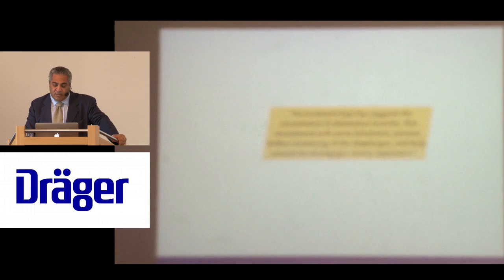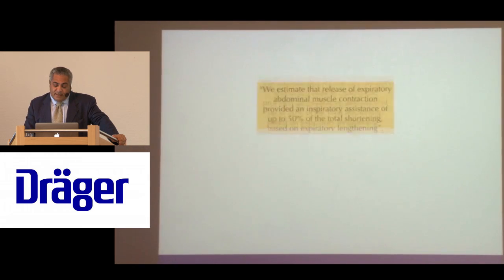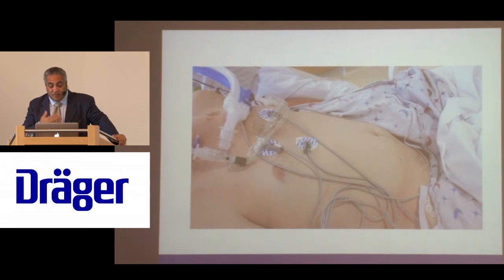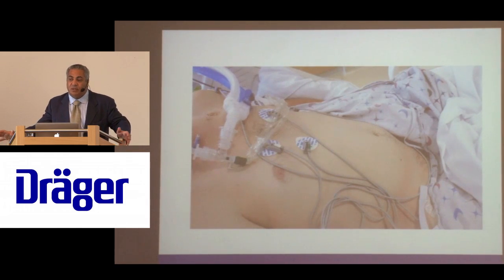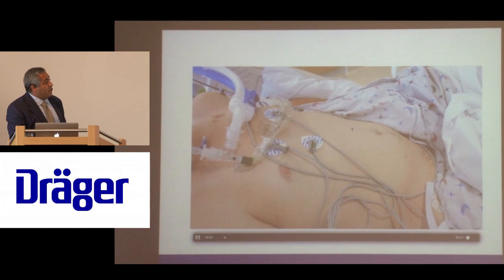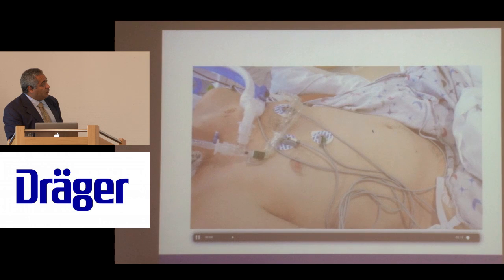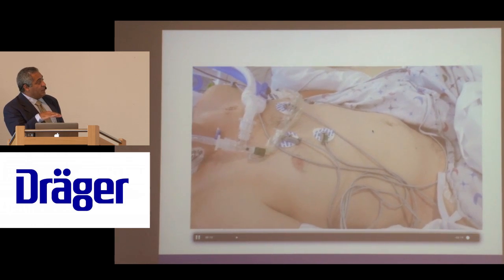And maybe the best thing to do is actually look at patients on APRV. So these patients are on APRV, and we use the way they breathe, which muscles, because I'm trying to understand what their brainstem is thinking. Which muscles does it want to control? So if you watch, this patient is going to defend their lung volume. Now you can see they're squeezing here. So they're on that CPAP level and they're squeezing down.